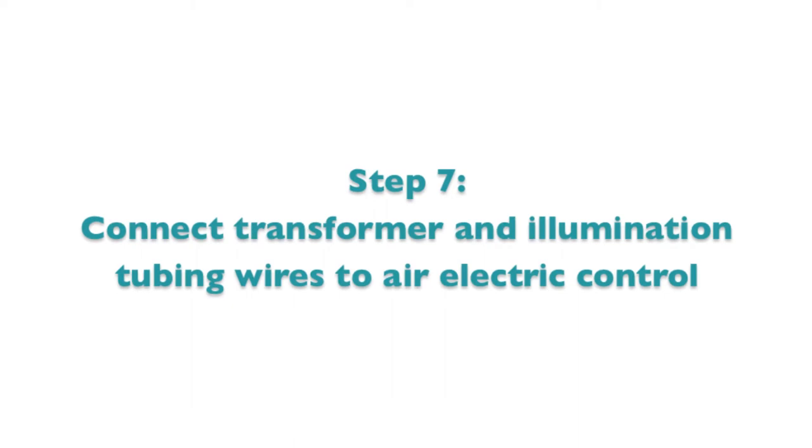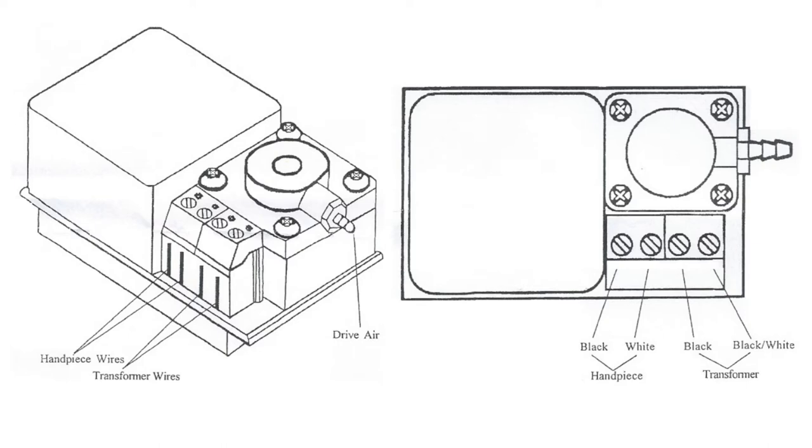It's time now to connect the wires from the illumination tubing and the transformer to the air electric control as shown in this diagram.